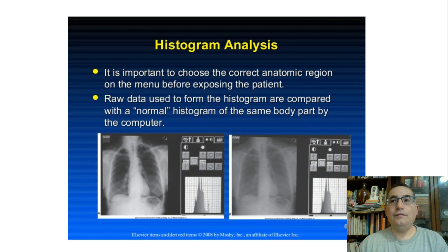We did a chest x-ray, first under a normal procedure. Then we did that radiograph a second and third time, first processing it as a skull, and then second processing that same chest x-ray where all the parameters were the same, including things like SID, collimation, our technique. The only thing that changed is the algorithm, and what we did on the third one is we processed it as a foot. That particular image, I think, was the most dramatic.